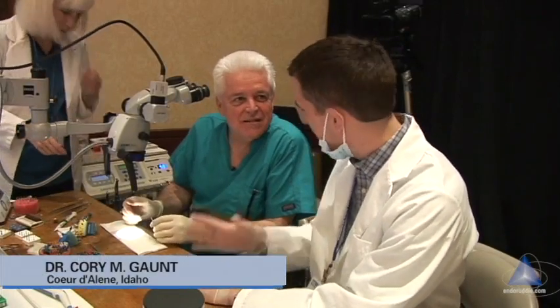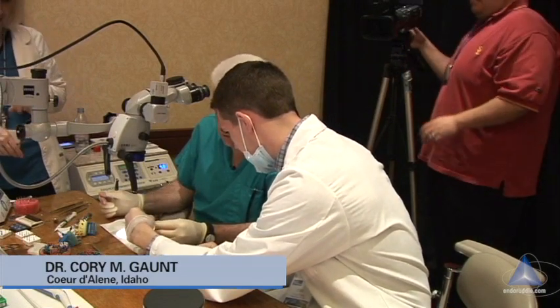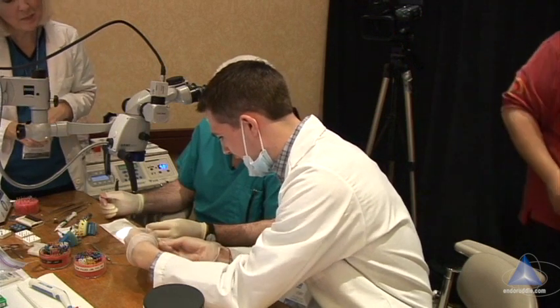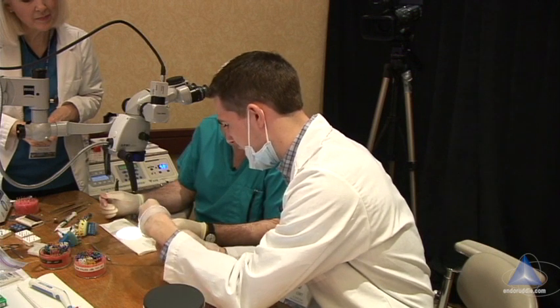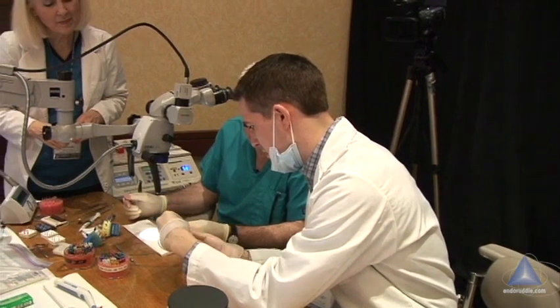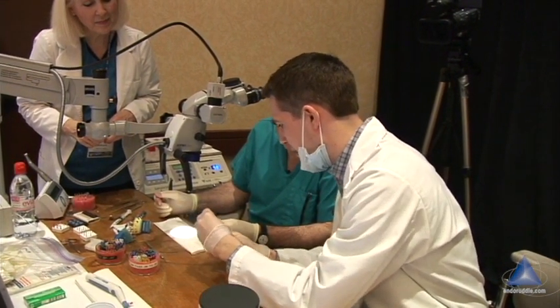My concern here is that I'm looking for a file that goes in my canals and is upright. You're okay about the upright part? I'm leaned in, which I don't know if the shape of my roots means I'm never gonna get to be like this. There's my mesial buckle, distal buckle — see how it's not uprighted.